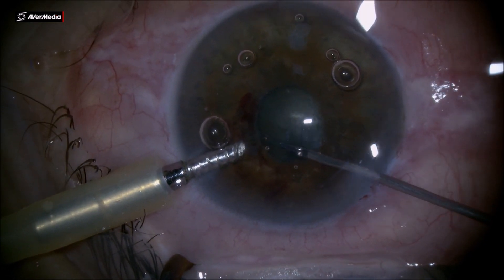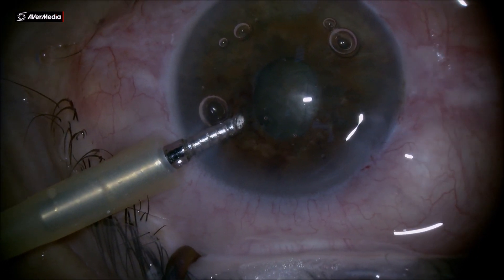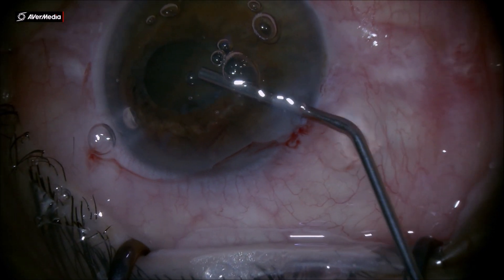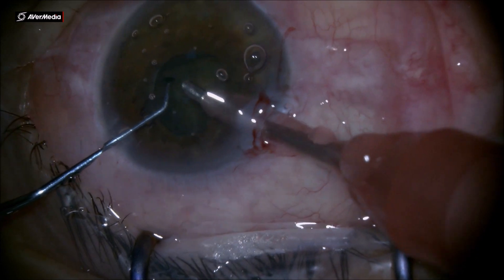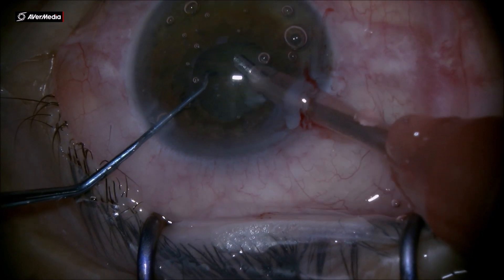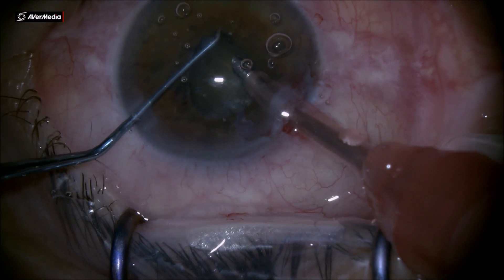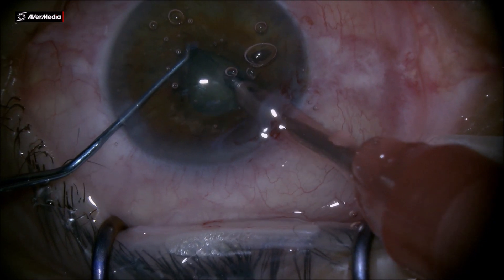Having such a small anterior chamber, I will try to avoid hydrodissection and hydrodelineation to not inflate the bag even more. You can potentially have a break in the posterior capsule doing this, or you can even get the nucleus out of the bag and stuck to the endothelium, which is not nice — especially in glaucoma patients where you need to keep inflammation at a minimum. So I do a trench here.